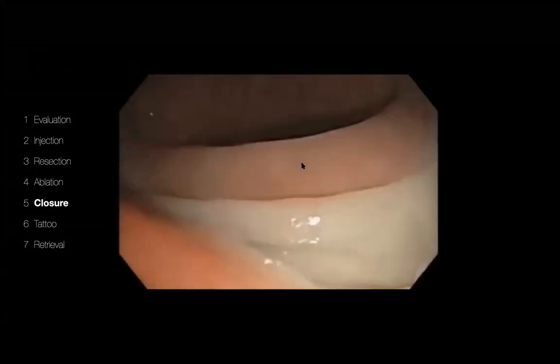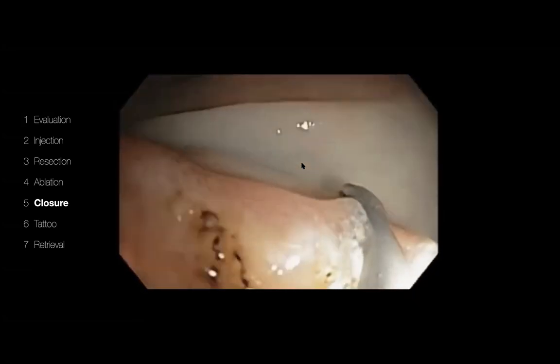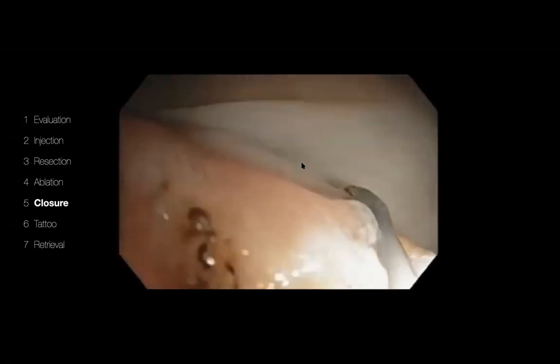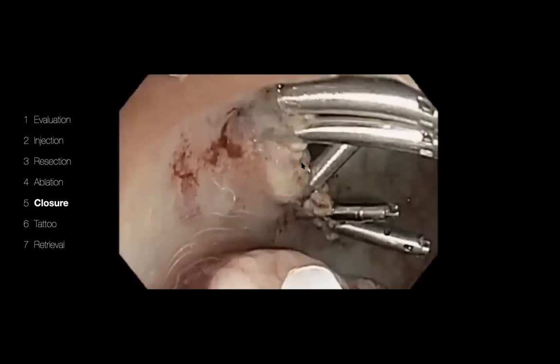There have been studies using ultrasound to show that lesions that are polypoid have much larger arterial and venous vessels. So these are the reasons. You actually had shown us the stump of an artery before. Those are the direct proof that these kinds of lesions have significant size vessels.